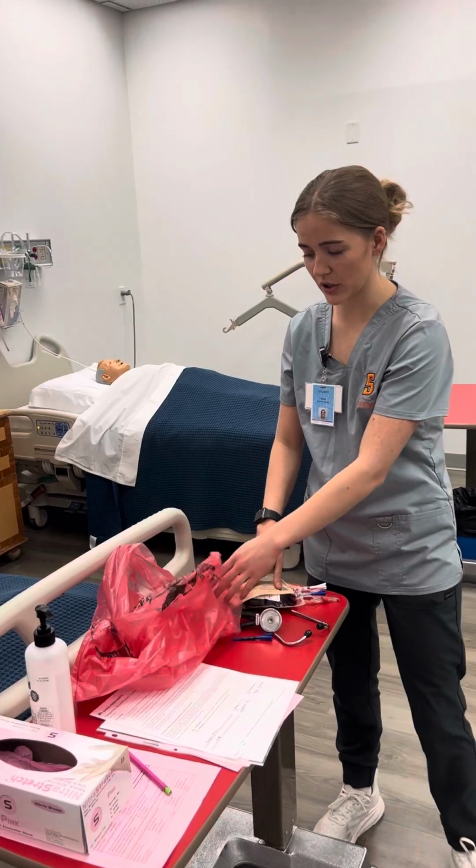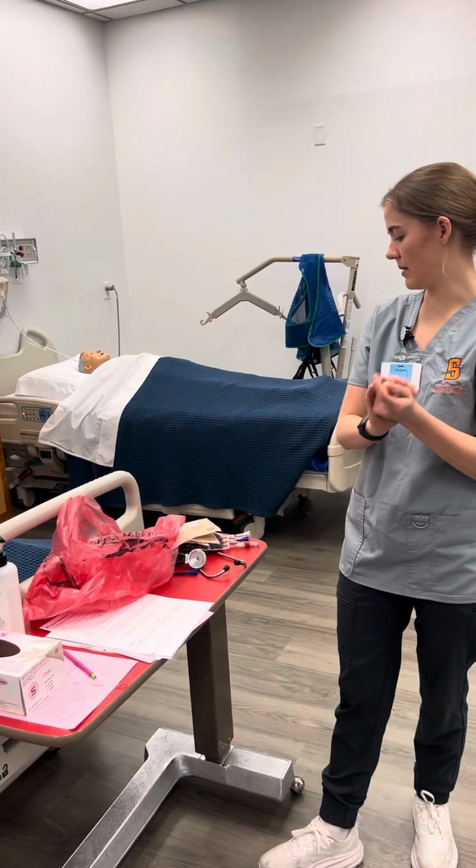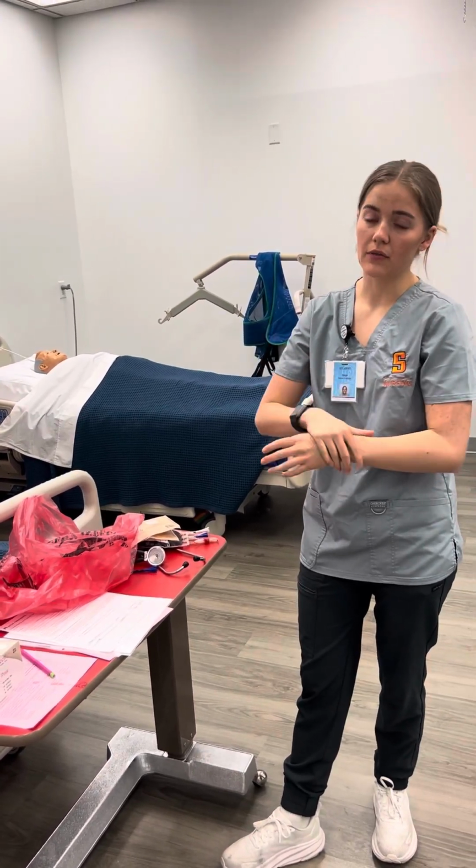And I'm just gonna make sure that I use this blood within a 30-minute period after removing it from the fridge and administering it within a 4-hour period.